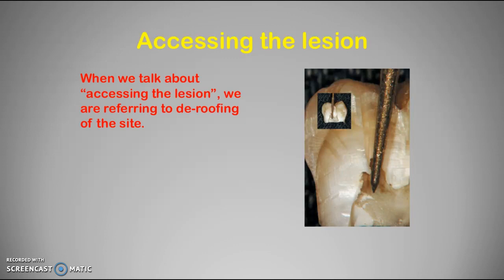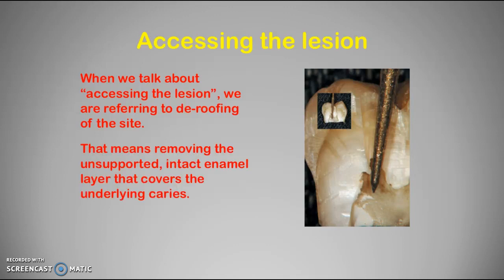When we talk about accessing the lesion, we are referring to de-roofing of the site or removing the enamel from that site. That means removing the unsupported, intact enamel layer that covers the underlying caries. It must be done in a minimally invasive manner.